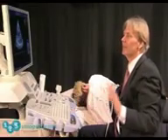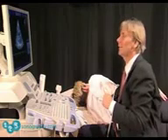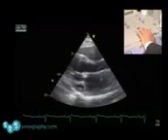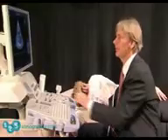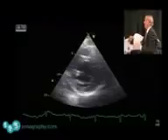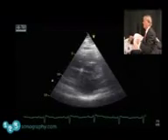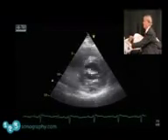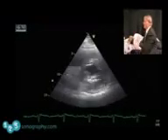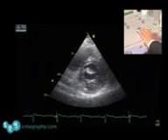This is a typical spectrum of changes that you see following rheumatic heart disease, with doming of the anterior leaflet as the leading problem in this patient. Now we'll look at the patient in a short axis view, which is very important because we want to look at the opening of the mitral valve. We have to look at exactly the level of the mitral valve, which is approximately here. And then in early diastole, we can freeze the image.